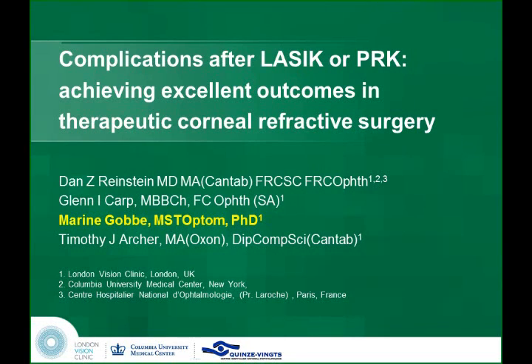The thing I was going to mention was, for example, where this doesn't work as well is in hyperopic wavefront-guided. And that's probably because the epithelium thickens so much more in hyperopic corrections than in myopic corrections, that the error of the topography is higher, error versus actual stromal surface, which is something we're going to cover later.